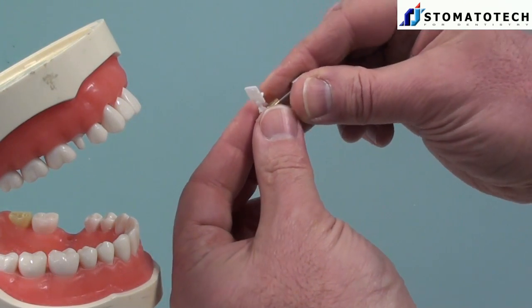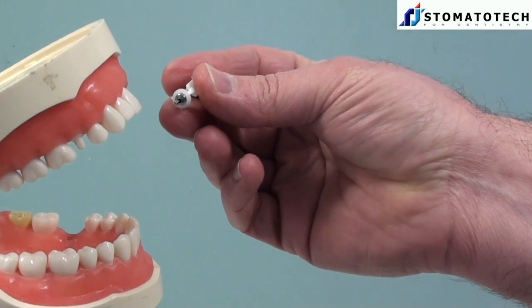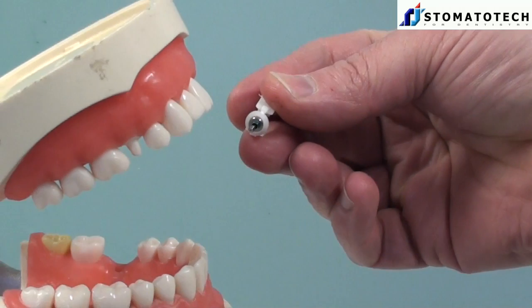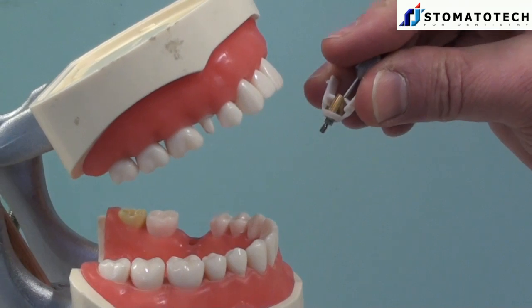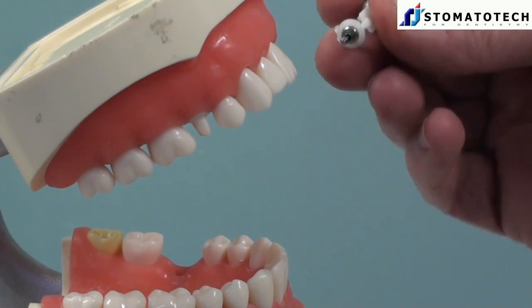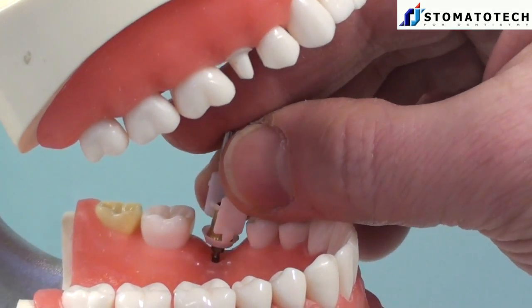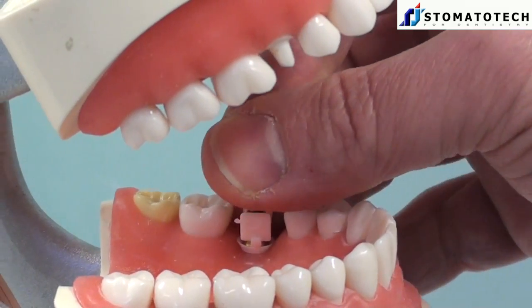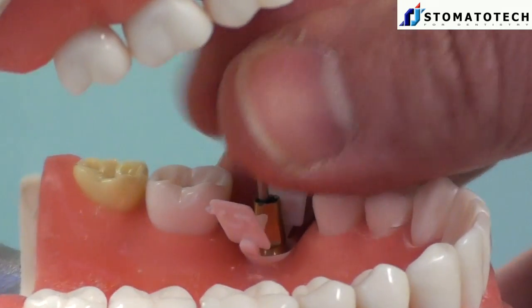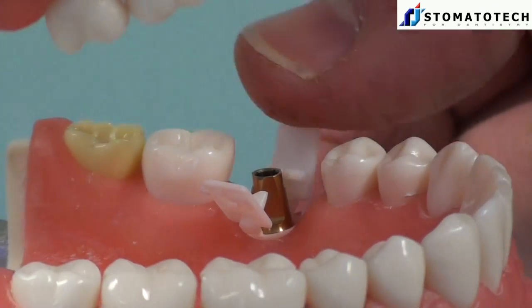I place the abutment in the G-Cuff and I close the tabs and I grip it like that. This is a very comfortable way to hold the abutment, especially if it is a very small one and if the tooth is in the posterior area. So I am just going to place it like that and I close, and that's it.